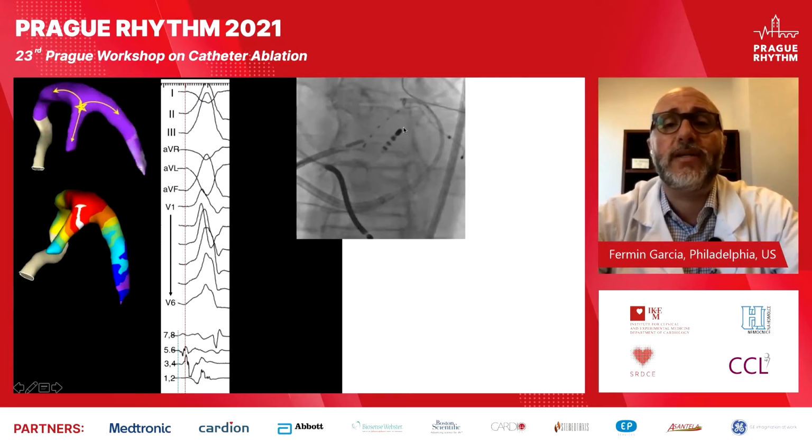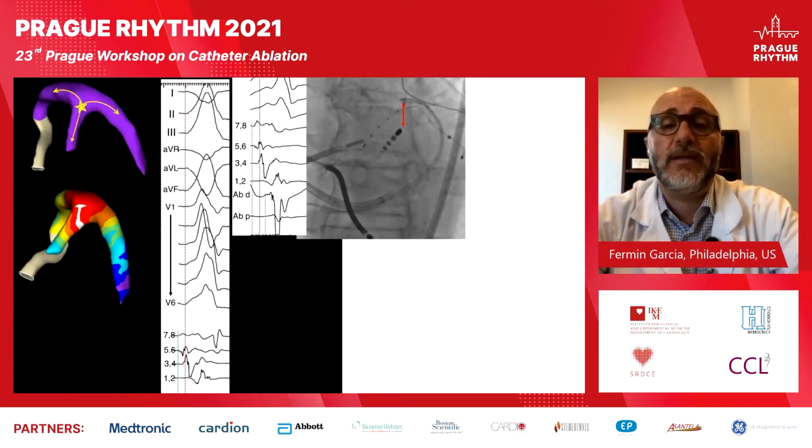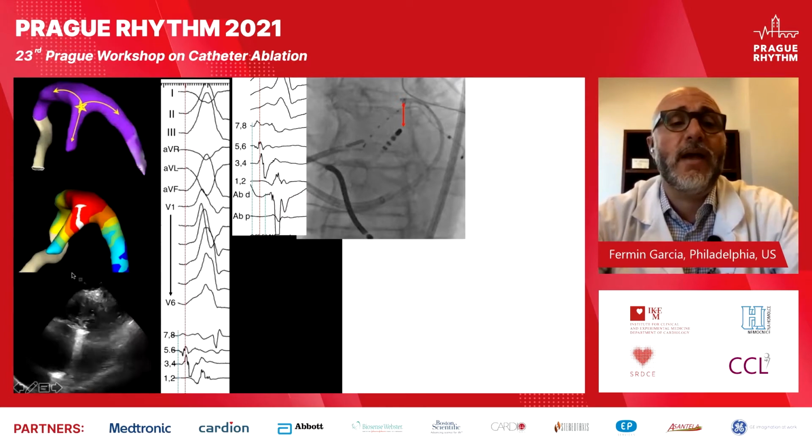So we're going to put our ablation catheter close to the closest area, in this case, the proximal poles. When we look at this, the signals in the ablation catheter are super late compared to the earliest signal on 7/8. But we have described, and others have too, that if the distance between these two catheters is less than 1.2 or 1.3 centimeters, an ablation lesion from the endocardium could affect the intramural space or the subepicardial space. So we decide to ablate, usually, as described here, starting on this area.